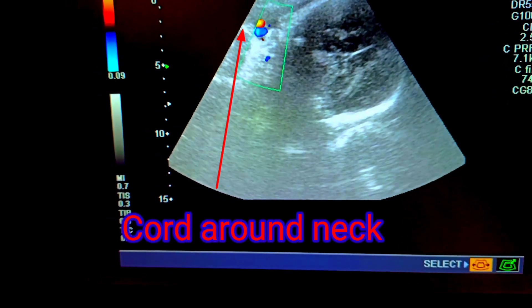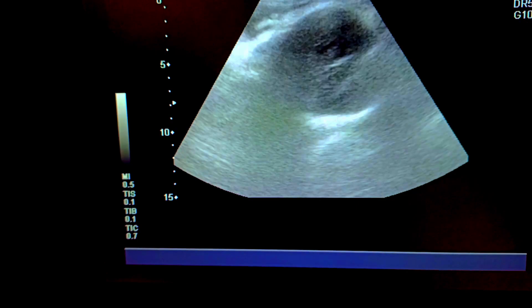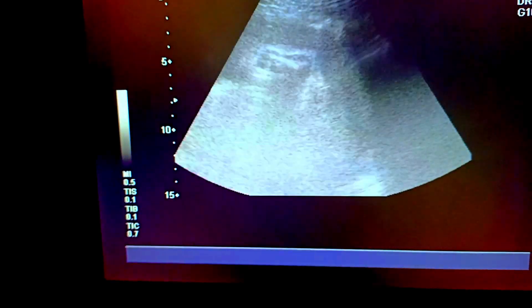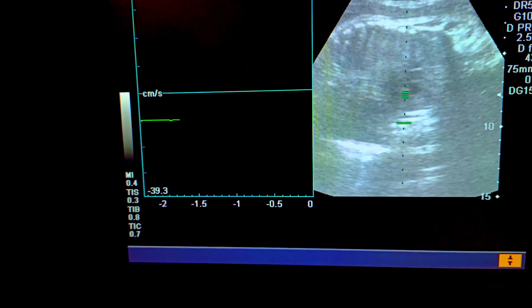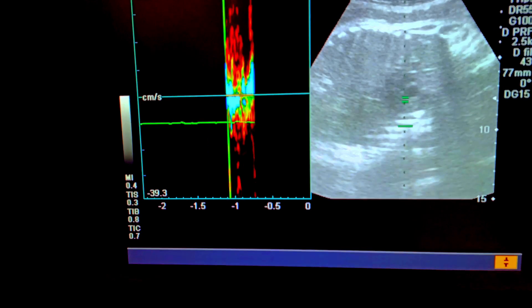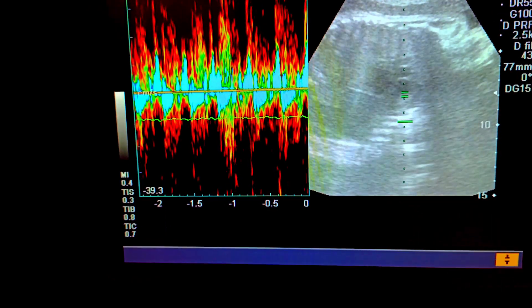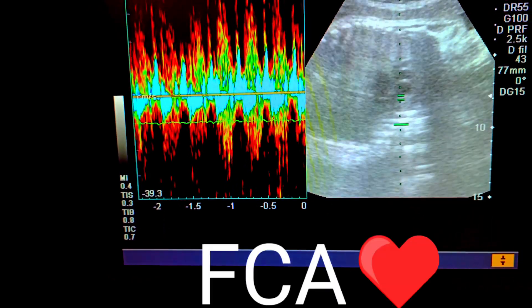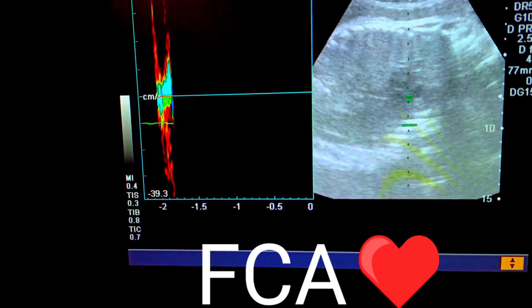Now, putting the color Doppler between the head and neck region, you will find the vessels that show the cord around the neck. You would also like to see the fetal cardiac activity, which is present.